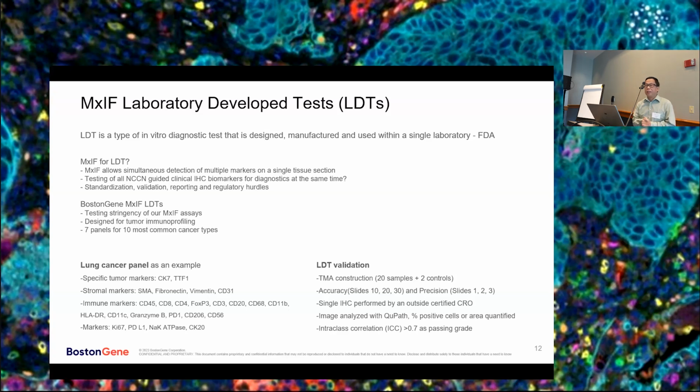For example, listed here: first, how to standardize different LDTs, how exactly to validate that, and how rigorous or robust the assay should be. And also, after you get these results, what's the standard form of reporting, so as not to extend any study into a long paper. And of course, there are also regulatory hurdles and insurance policy, which is beyond me.